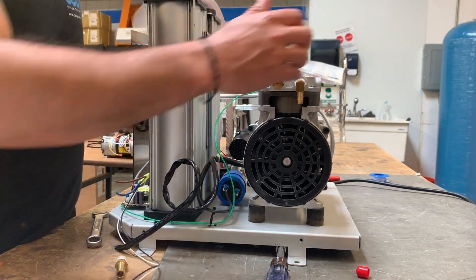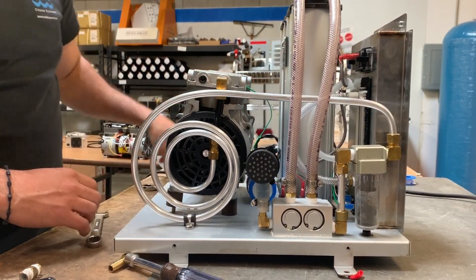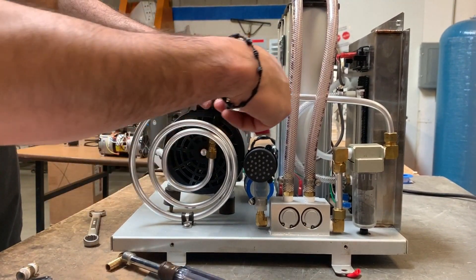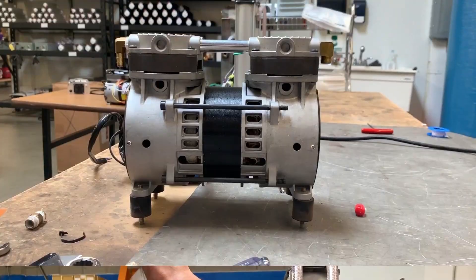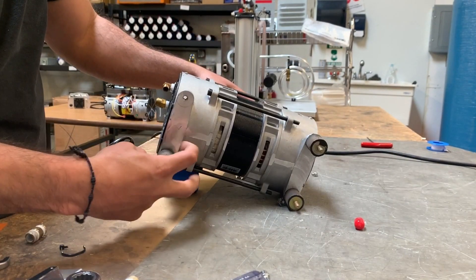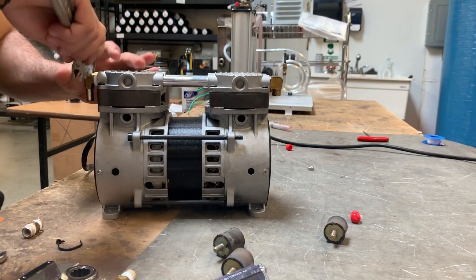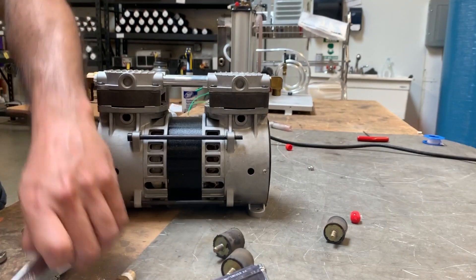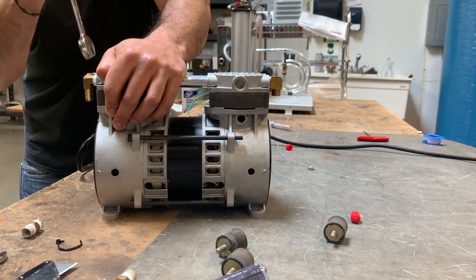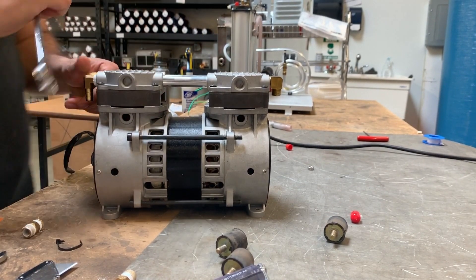Grab a 5/8 wrench and remove the fitting that connects to the cooling coil. Once the compressor is out, it's easier to work on. Remove the rubber feet — you're going to reinstall them on your new compressor. Go ahead and remove all the fittings and remove the pressure relief valve. It's most likely still good — remove it, re-tap the line, and reuse it.